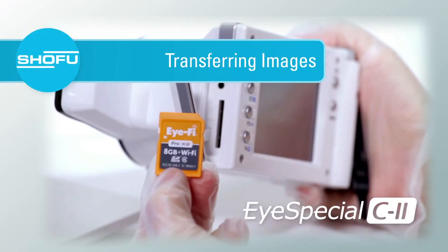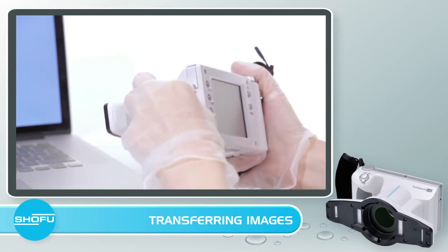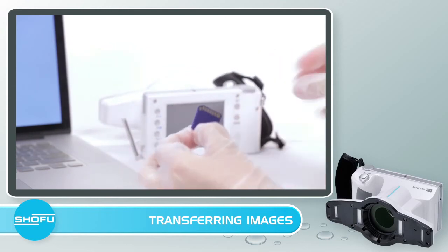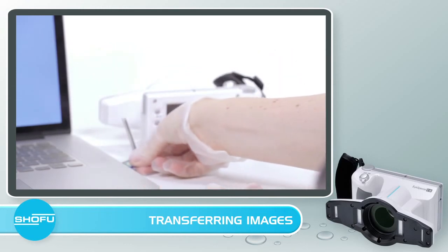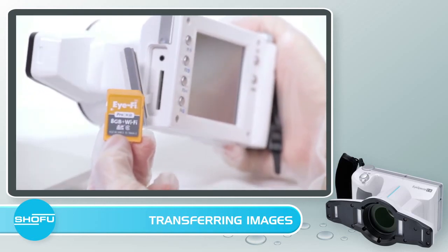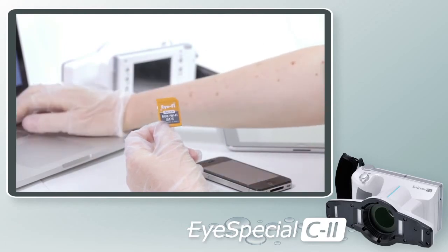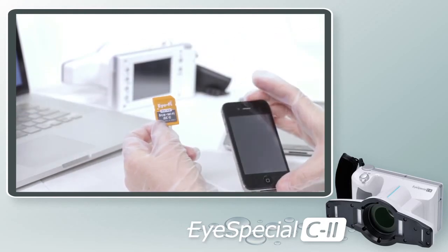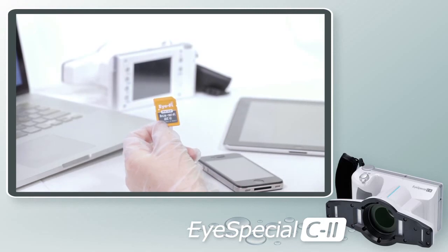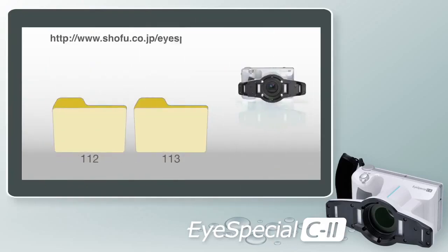Transferring images with the iSpecial C2 is quick and easy, with two options. One: take the SD card out of the camera and place it into the computer to begin transferring files. Two: use a wireless SD card that will automatically stream images from the camera onto your PC or Mac — wirelessly streaming photos to your PC, tablet, or smartphone, saving staff time and making chair-side consultations a breeze. The iSpecial C2 also comes with SureFile, a proprietary photo management software that automatically sorts and files images by patient ID number.